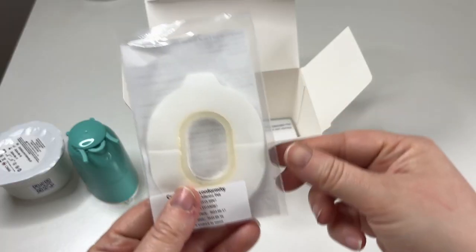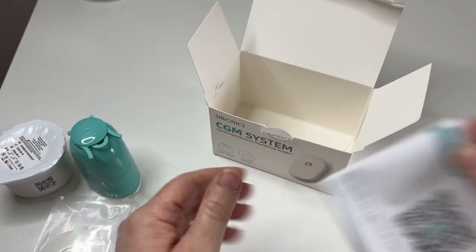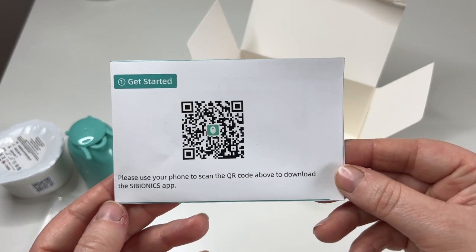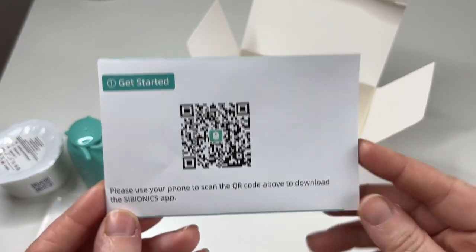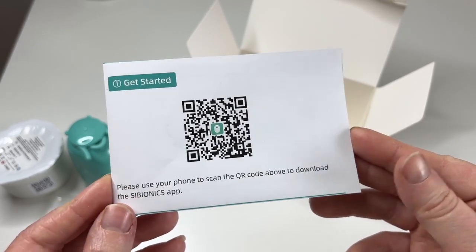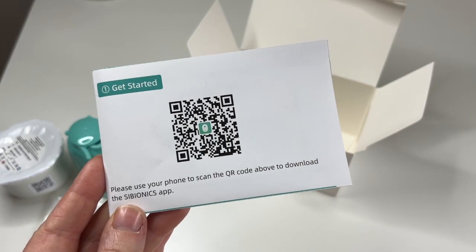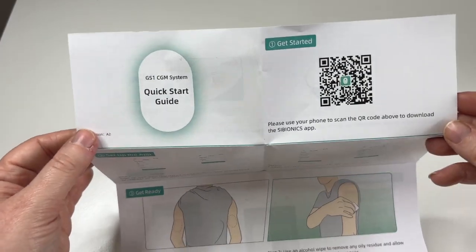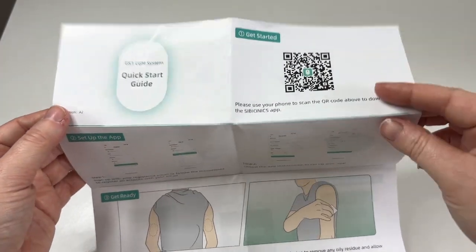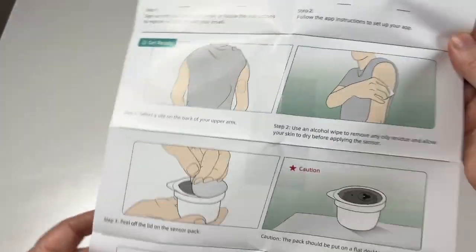Other things we have here: an over patch that's going to go on top after we've applied the sensor, and then we have some instructions. So far, from what I believe, there is just an app — I don't know anything about receivers. I'm going to use the app in this video; I've already downloaded it and registered. So putting aside our application pack for a second, I'll have a quick look at the starter guide.